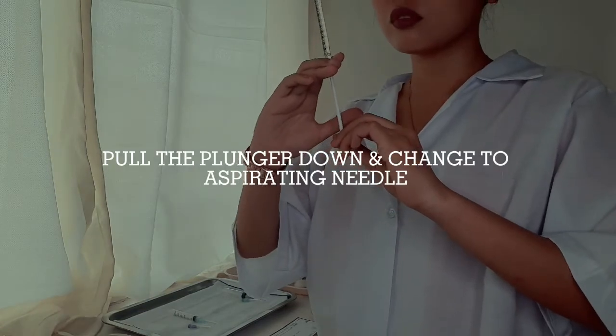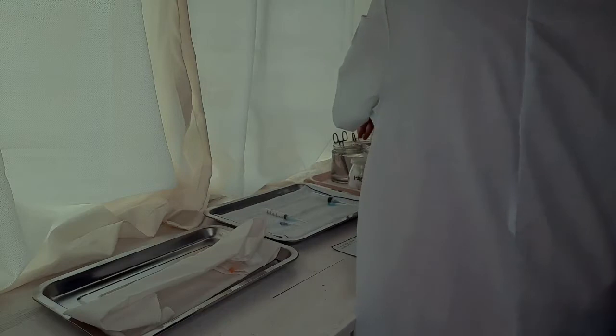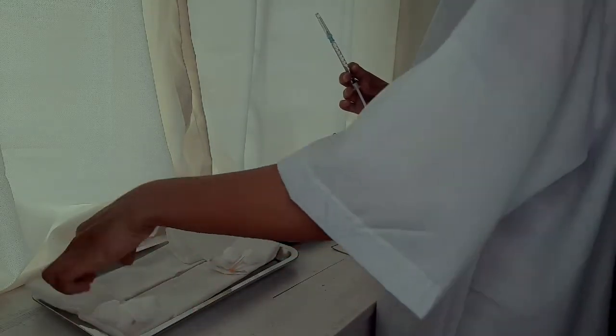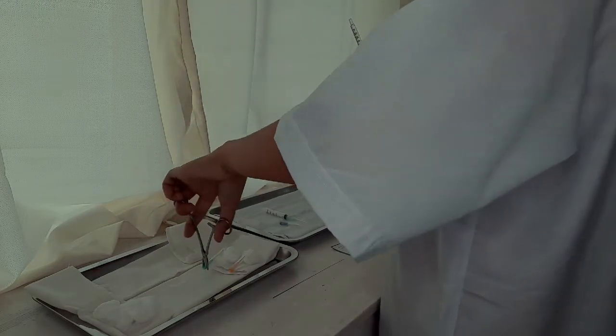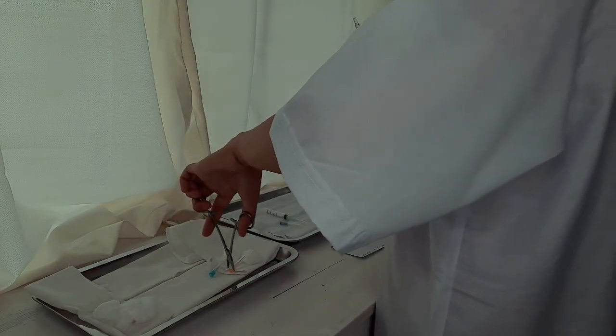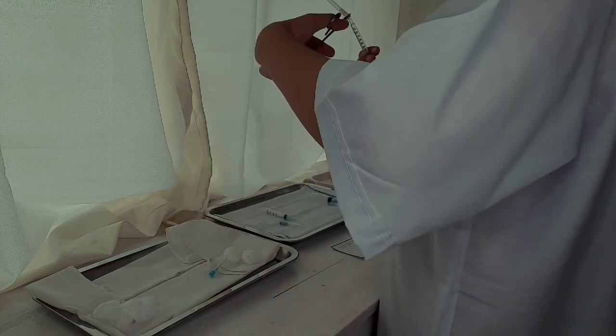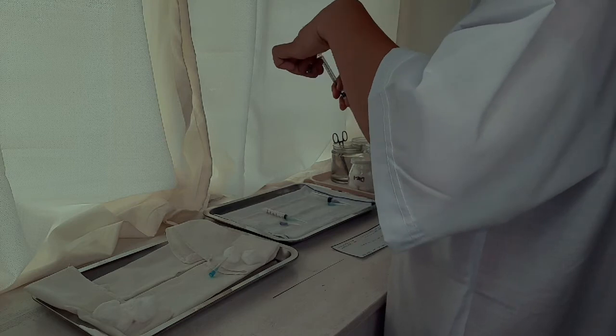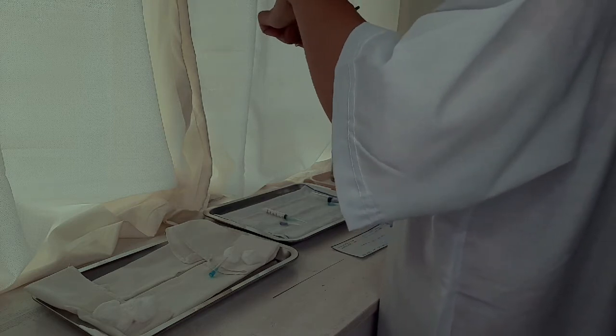Pull the plunger down and change the aspirating needle to the gauge 25 for injecting. Pull the plunger down prior to changing the aspirating needle. Avoid wastage of the medication. Align the bevel of the needle to the calibration of the syringe, recap the needle loosely, and return it back to the syringe towel.